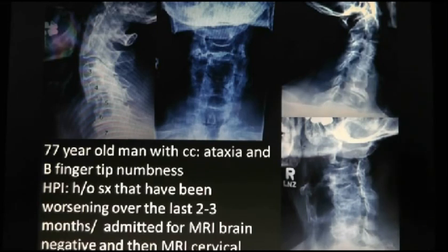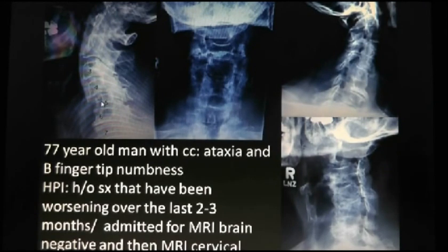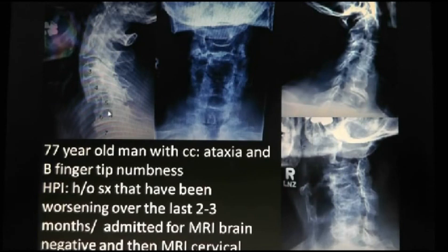What do you see on the x-rays, Adam? At 4-5, you can see the anterior listhesis of C4 on C5. And C5-6, C5's a little bit retrolisthesed on C6, but there's also loss of disc height there. C6-C7, there's hypertrophic end plates and osteophytes. You can't see them posteriorly, but it's probably extending posteriorly into the spinal canal pretty well.